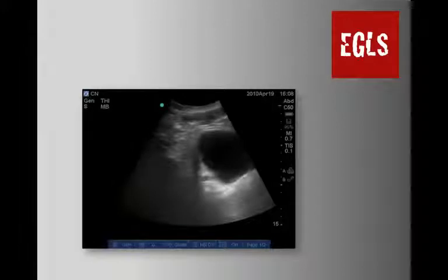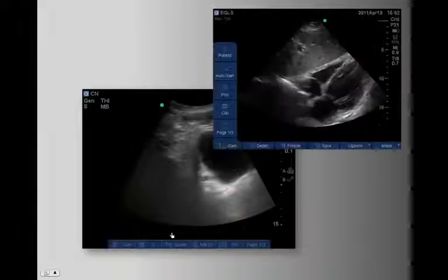And finally, here we go to the pelvis in the longitudinal view. So we have the bladder right here. And left of this line, there's absolutely no structured image because of bowel gas that disperses the ultrasound beam. We see refraction or edge artifact on the edges of the structure containing fluid and enhancement in the far field of the bladder.